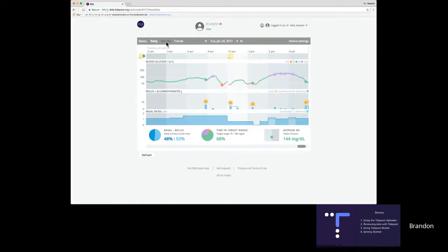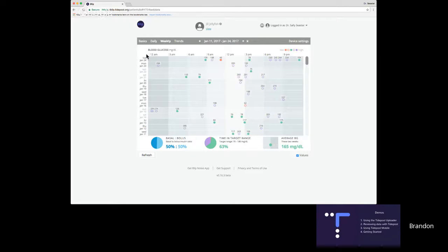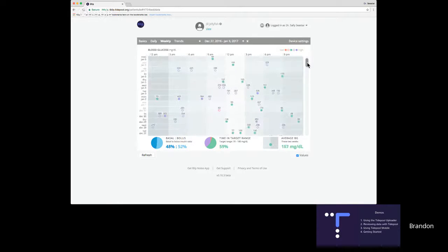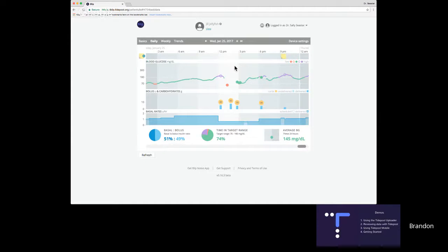Now let's take a look at the weekly view. The weekly view provides a glimpse of blood glucose readings — we have the last two weeks of data on the left side in reverse chronological order, and then midnight to midnight along the top. You can see all of Jill's blood glucose readings, and you can scroll down to change the two weeks in view. Just like the basics screen, if there's any reading that's concerning to you, you can click on it to get the details.